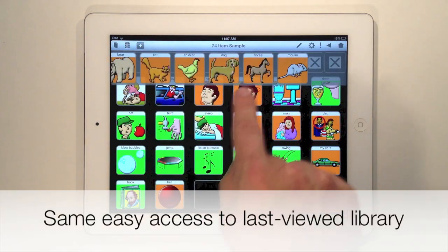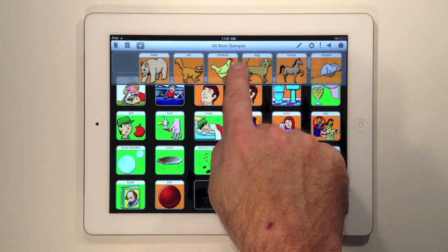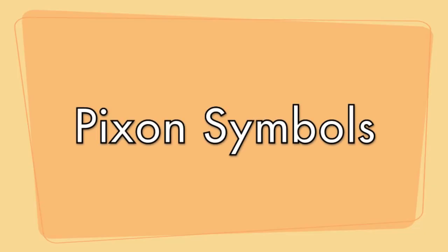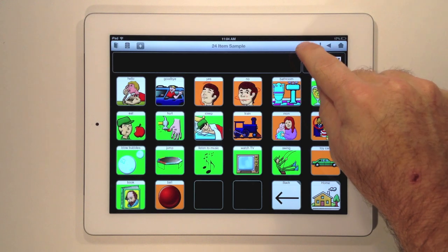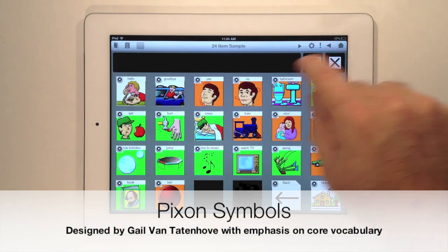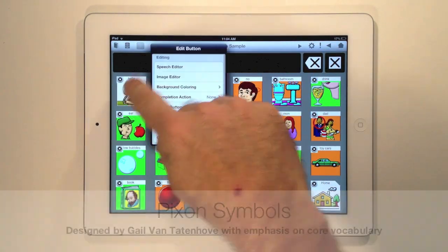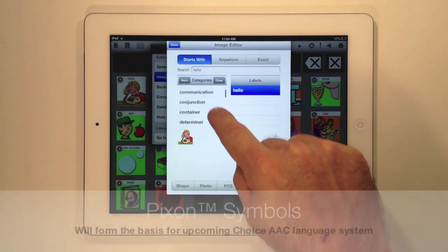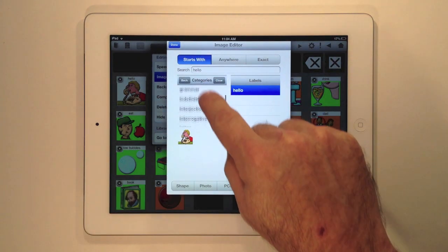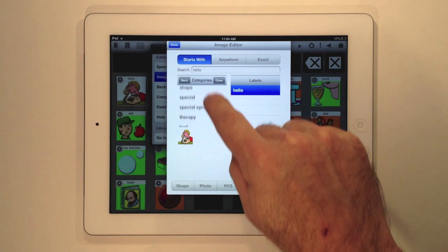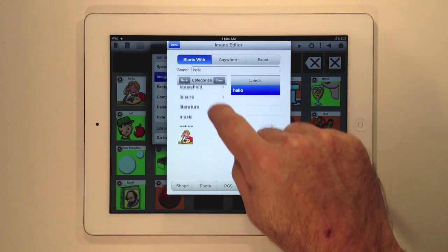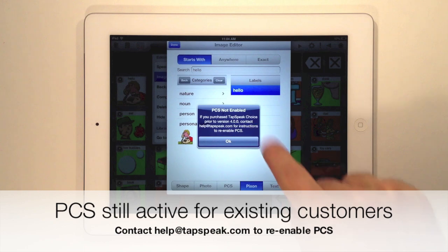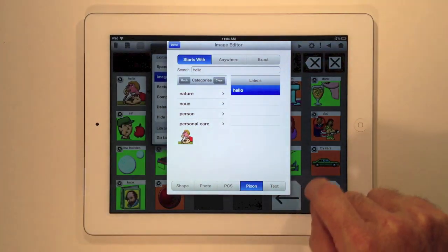And finally, we've enabled you to access libraries just like before with the last entry on the drop down. We're now using Pixon symbols designed by Gail Van Tatenhove and licensed from Semantic Compaction Systems. Pixon symbols are an improvement over PCS in that they're explicitly designed for core communication. Pixon symbols will become the core of our Choice AAC page set, and PCS symbols are still available for existing customers.